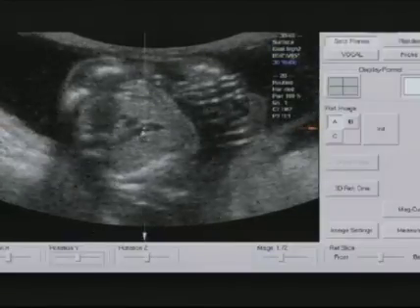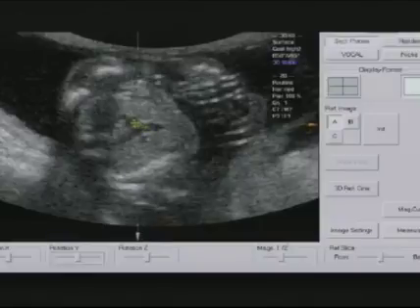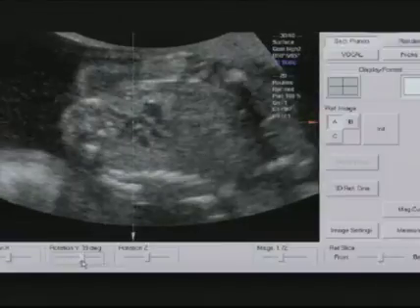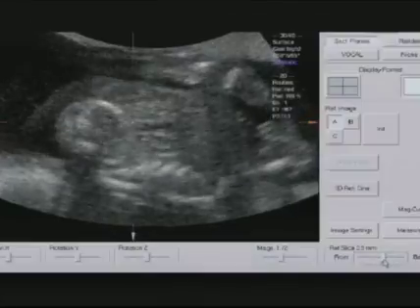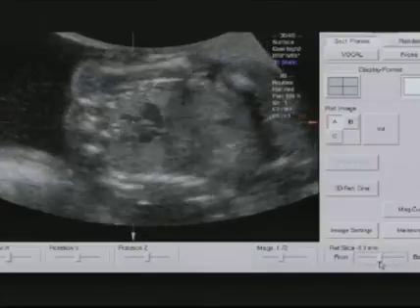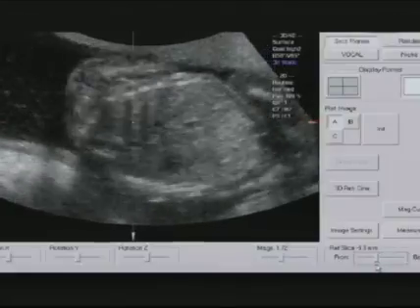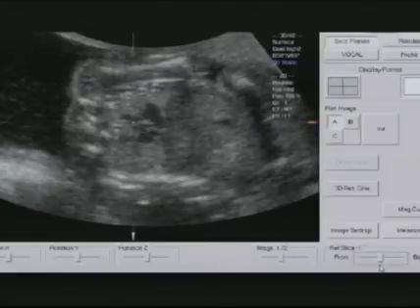Okay. Now I'm going to put my dot on the aorta. That's a piece of the aorta just behind the pulmonary artery. I'm going to open it up again using my Y rotation, and here is my aortic outflow. So now I've examined the heart within the volume that was taken by somebody else who may not know the anatomy of the heart, but I had the volume and I could examine it.